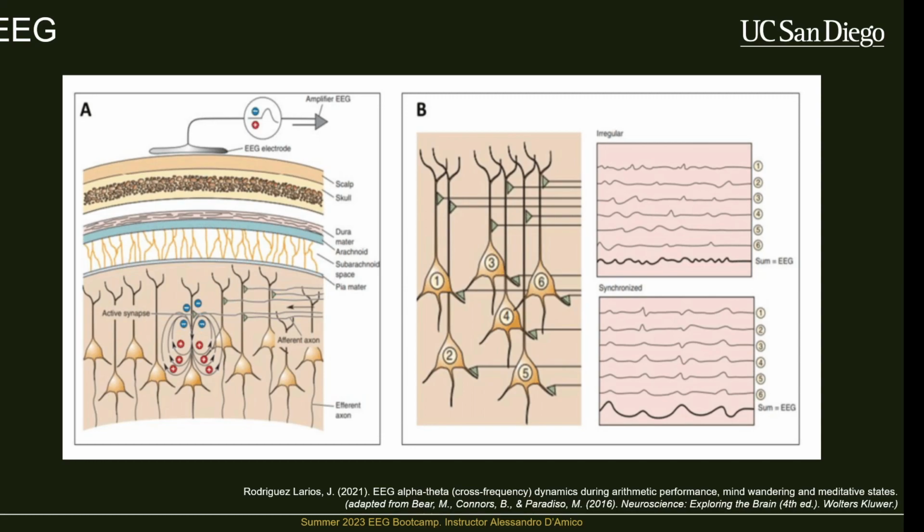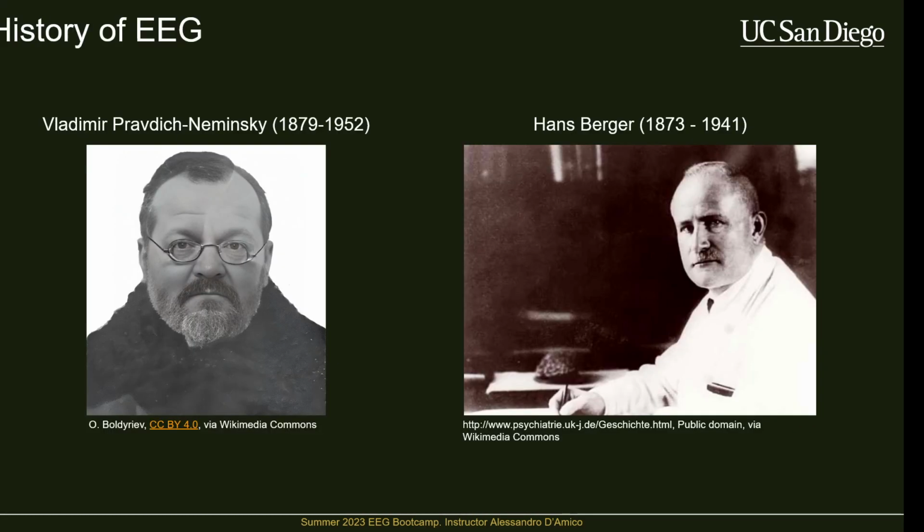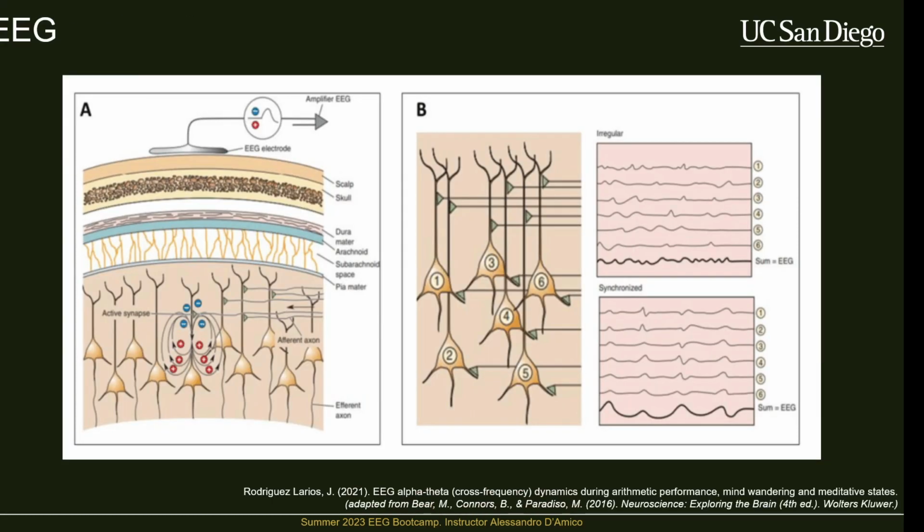But yes, what's up? Is that why the frequency range is typically under 100 hertz, or is it the same for electrical? It's a good question. Part of what you can measure is going to be limited by this fact. Even if you're recording LFP activity, you're still typically seeing oscillations in the higher gamma range more readily than you're seeing them in EEG. Maybe some oscillation researchers can attest to that more, but you tend to see higher oscillations more clearly in more invasive recordings.